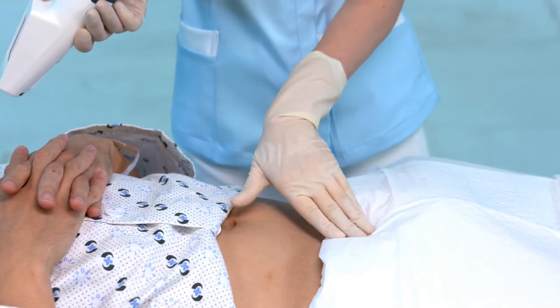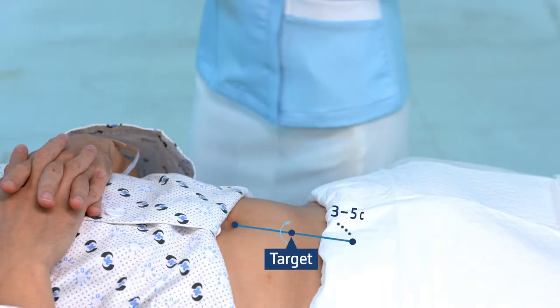Palpate the pubic bone. Draw an imaginary line that extends from the navel to the pubic bone, and place the probe on the patient's abdomen three to five centimeters above the top of the pubic bone.